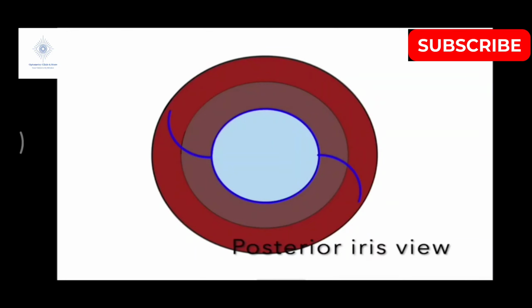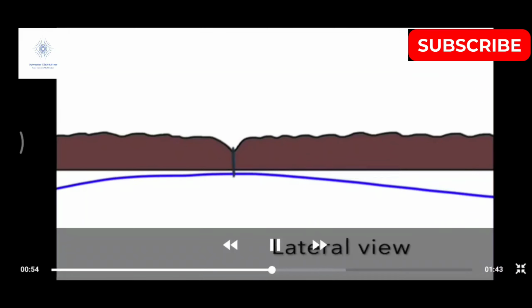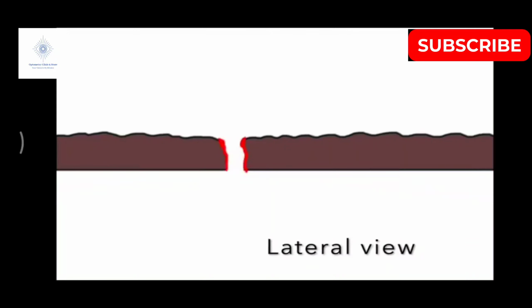The lens should be sitting just behind the pupil, and the haptics are fixed to the iris with loops of suture. One obvious way of removing the lens is to cut the iris suture from the anterior side using scissors or the vitrector. The induced iris trauma risks hyphema, and this method also risks losing control of the haptic and dropping the lens to the back of the eye.